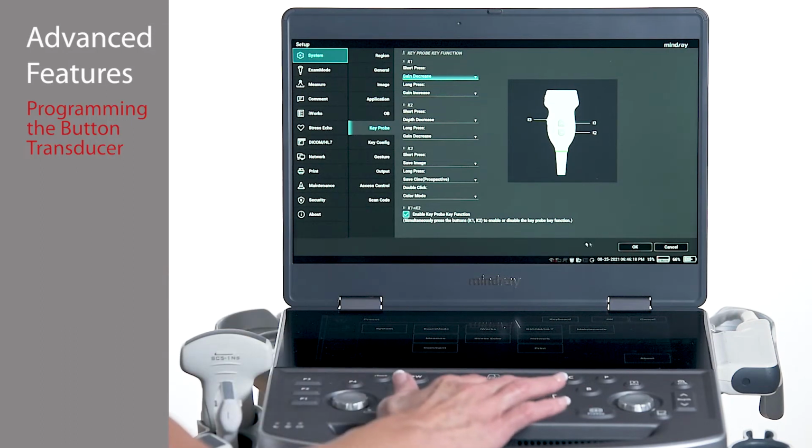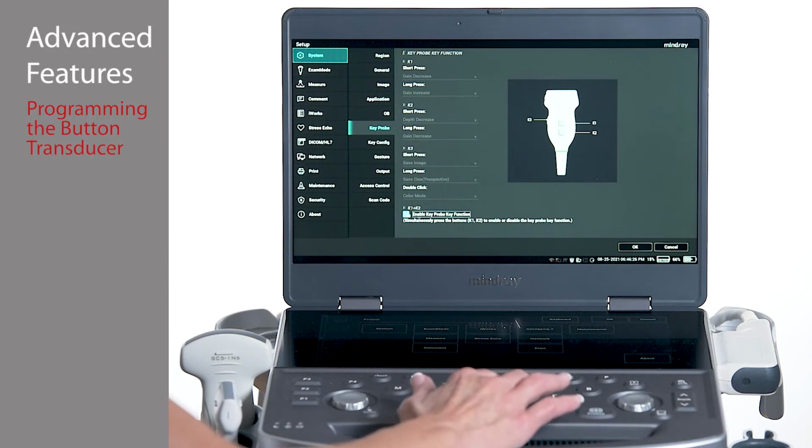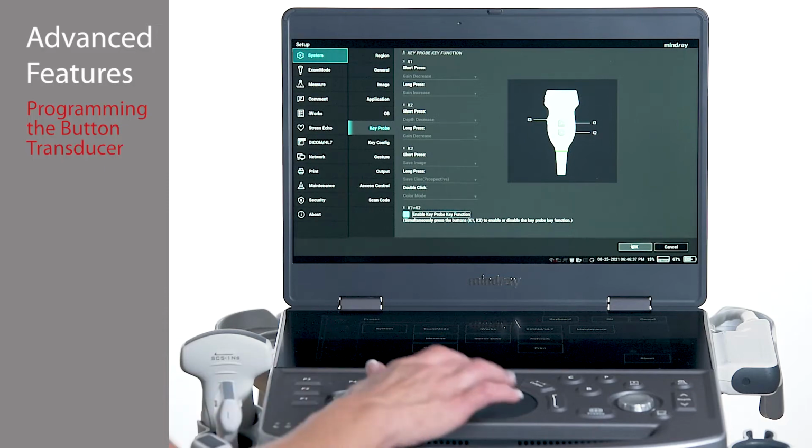Buttons may also be disabled by simply unchecking the box labeled Enable Probe Key Functions along the bottom of the page. Also, as noted on the screen, simultaneously pressing K1 and K2 will disable or enable the buttons during use so that there is no need to return to the setup page while scanning.